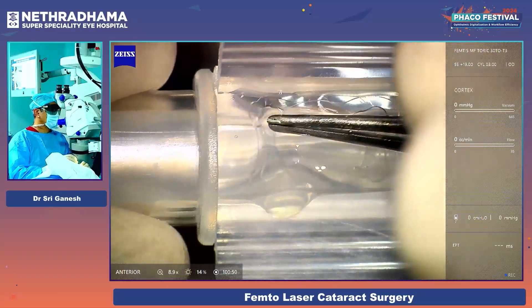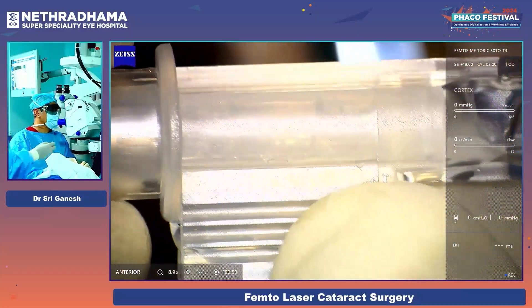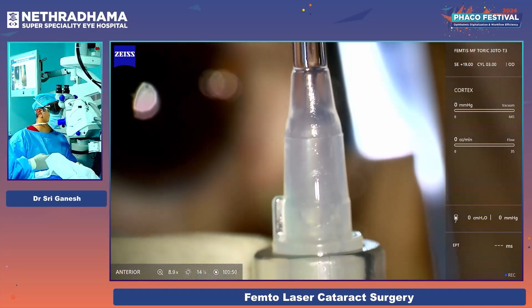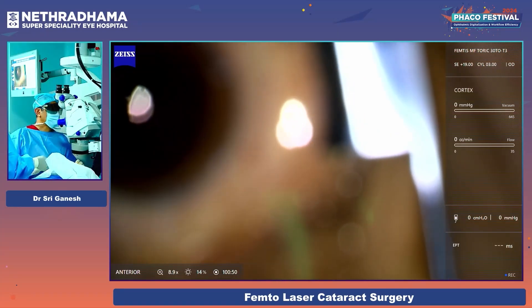You can see that now it is oriented correctly and I am loading the lens. The lens comes into the front of the cartridge.